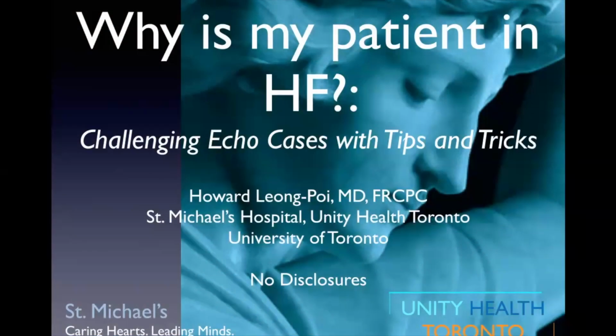Okay, so good morning, everyone. This is going to be a very case-based rounds. I actually like rounds where over half the slides have echocardiogram on them.